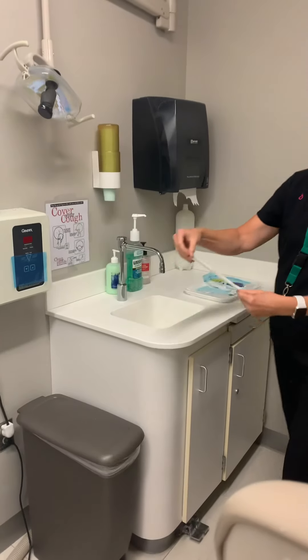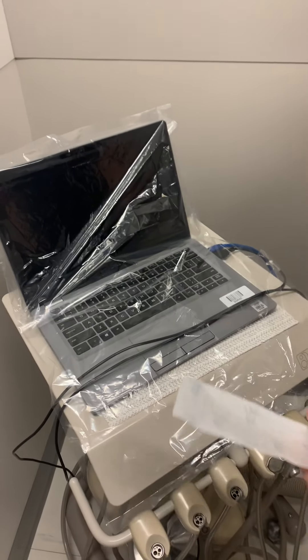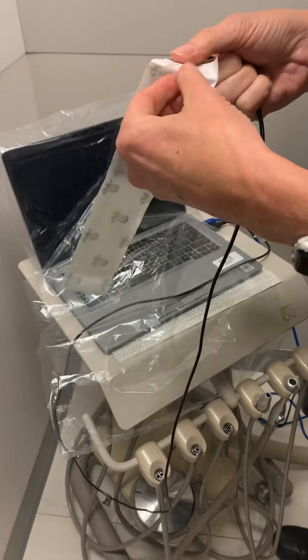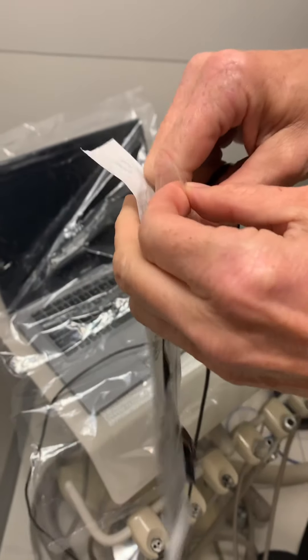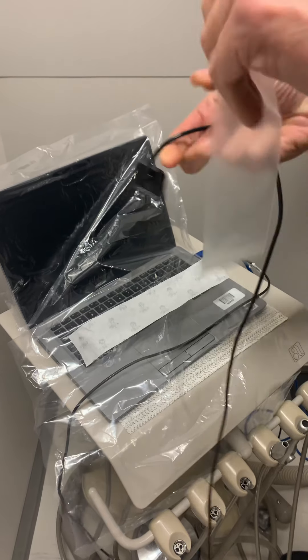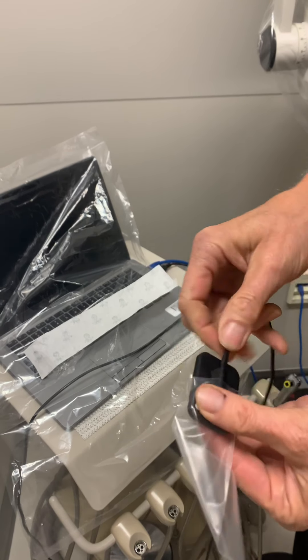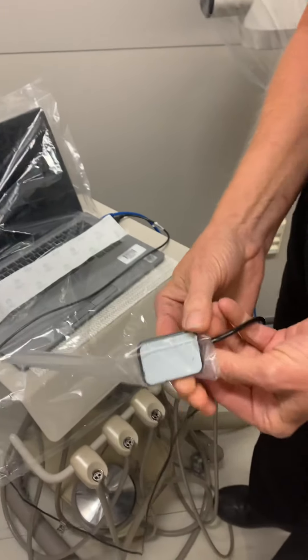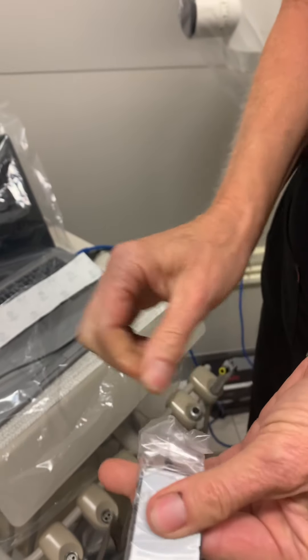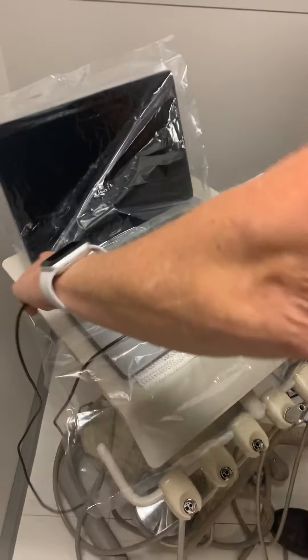Now we're going to take our sensor sleeve. The sleeve is open on the bottom and slides all the way to the end. We're going to take the sensor and slide it in the end here. These can be kind of hard to do sometimes depending on the sleeves, so you want to be very careful because these sensors are very, very expensive. She's just sliding it down on there, and then pulling the excess down over the cord, and then laying that on top of our barrier.